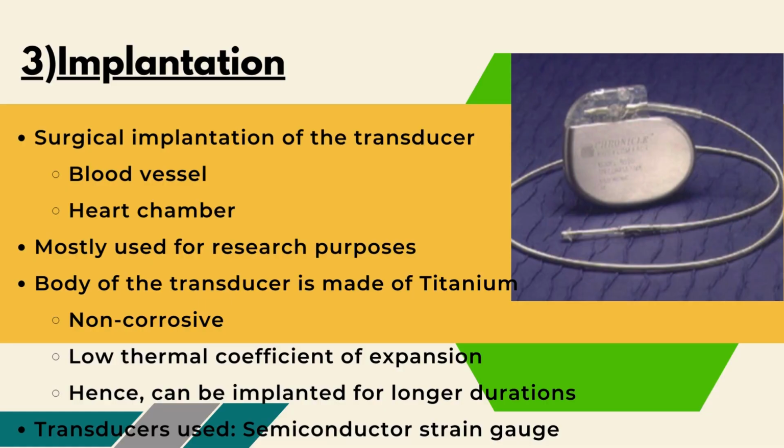Implantable devices. For long-term monitoring, implantable devices such as pacemakers or implantable cardioverter defibrillators can be used to measure blood pressure readings. These devices are surgically implanted and connected to a monitoring device, allowing for continuous monitoring of blood pressure readings.